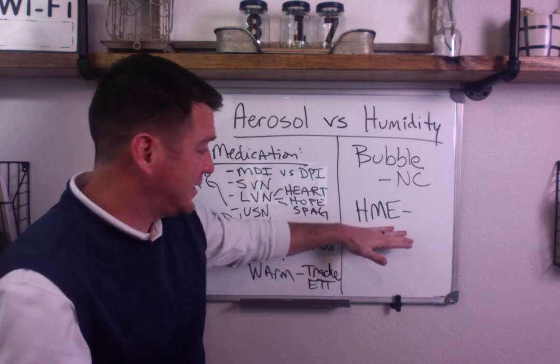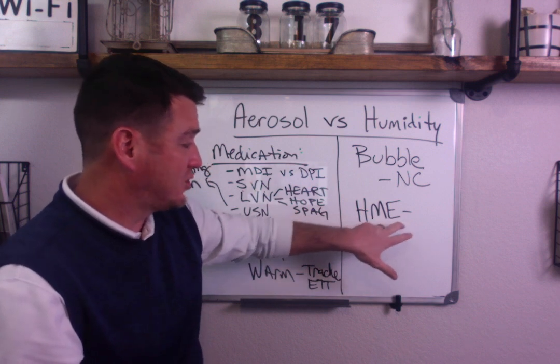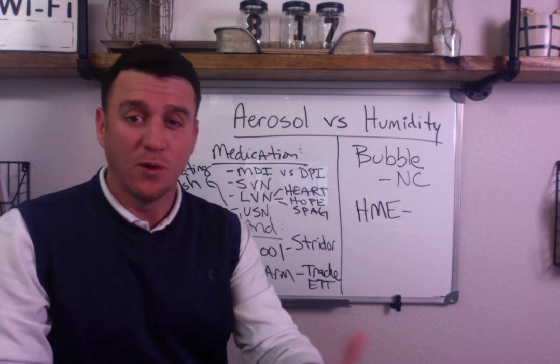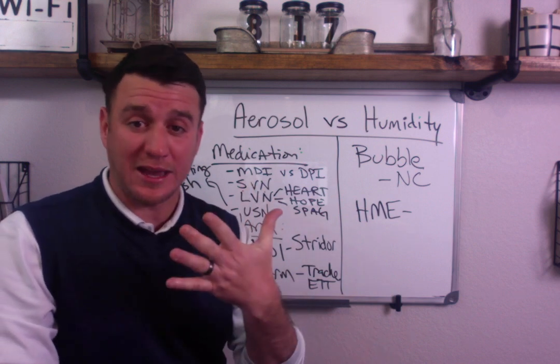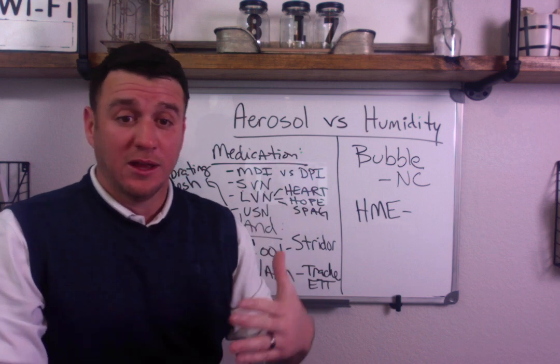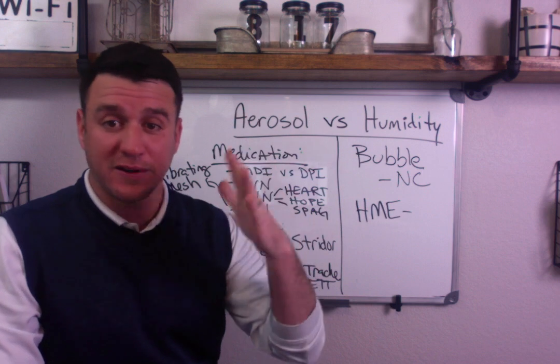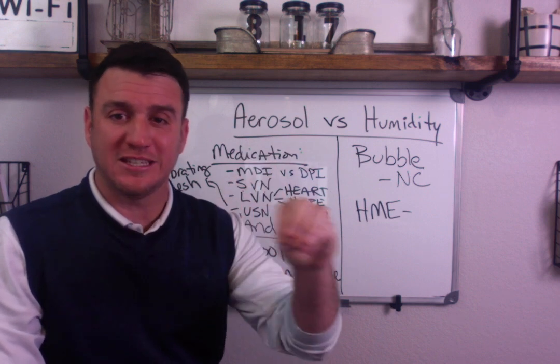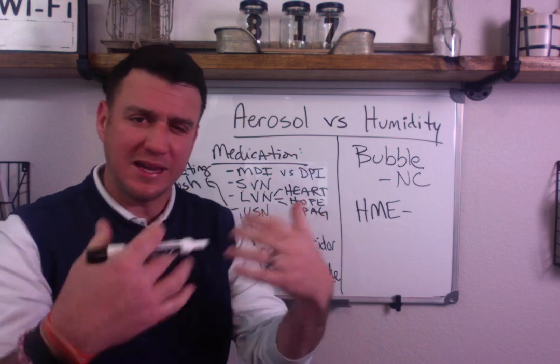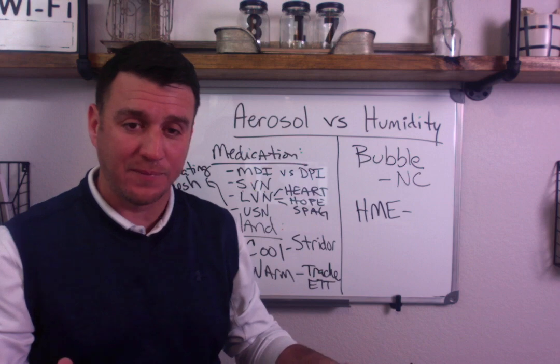Now, the last thing we need to talk about is the HME. This is the heat moisture exchanger. This is an artificial nose. So I just told you a little bit ago, we breathe in, we take in dry gas, it passes through our nasopharynx, through our nose, then we exhale, and when we exhale in our nasopharynx, we capture this heat and this humidity from that spontaneous breath. You see, when we inhale, gas is warmed as it reaches our alveoli.